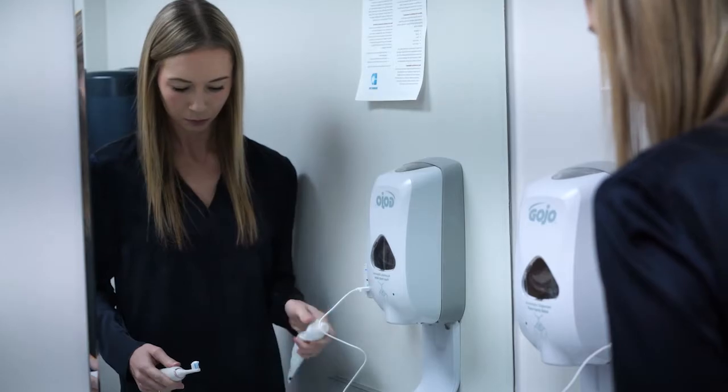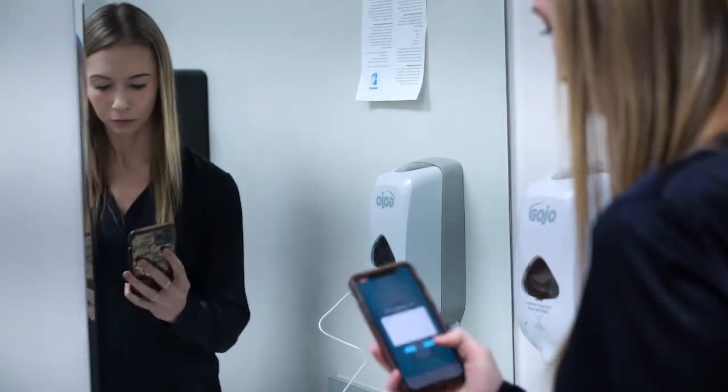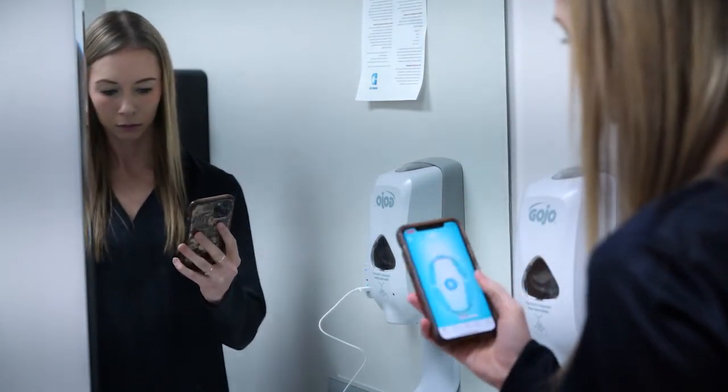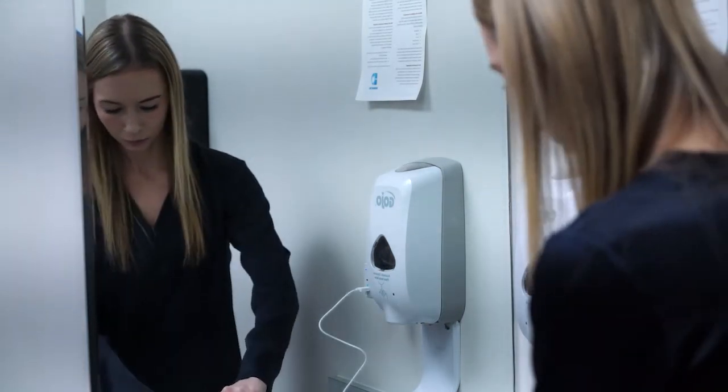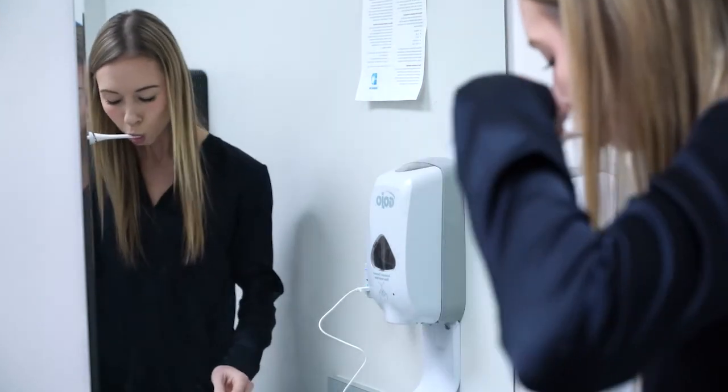Now it's time to brush. You'll get a friendly reminder to wet your toothbrush and to add your toothpaste. To get started, it will give you that reminder, and you can hit pair and it will count down. Apply some toothpaste onto the front of your teeth and turn on your BLU toothbrush to begin brushing.